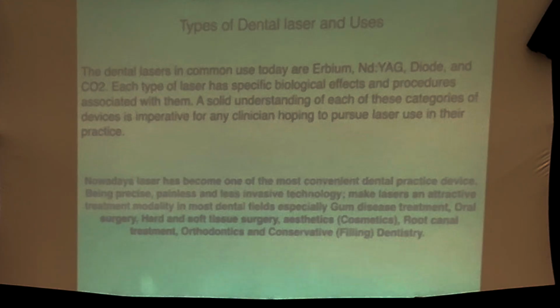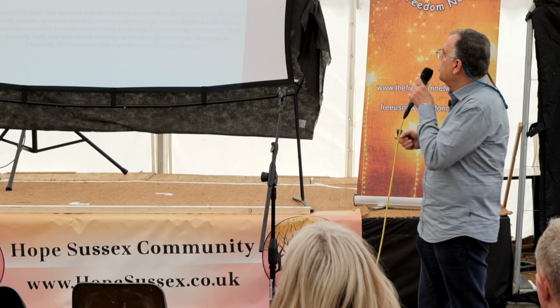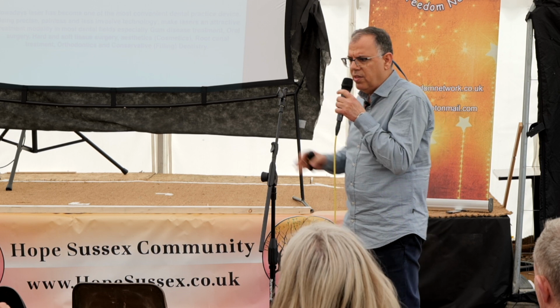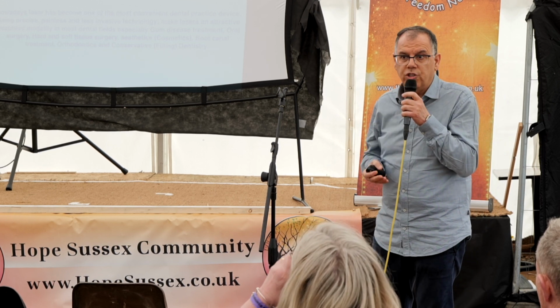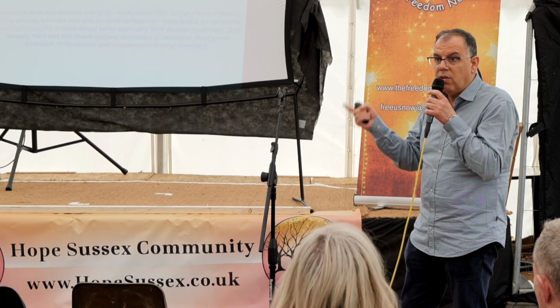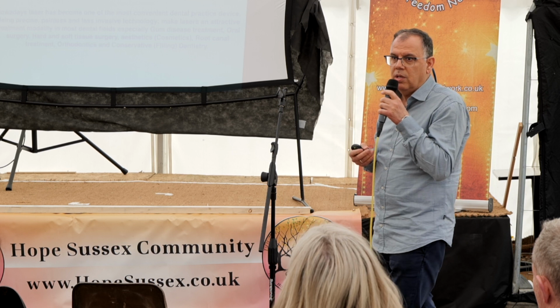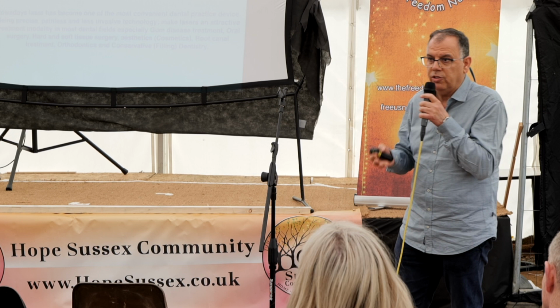Types of dental laser and uses. There are generally two types of dental lasers: hard tissue lasers and soft tissue lasers, as I said at the beginning. Until about 25 to 30 years ago, when the erbium laser was discovered, which is a hard tissue laser, with which we can do fillings and cavities, and bone operations, cutting the bone, sterilizing the bone, irradiating the bone. The unique thing about the laser is that it is the only tool that can stimulate tissue regeneration, whether soft tissue or hard tissue, around the teeth, inside the jawbone, and in our gum.